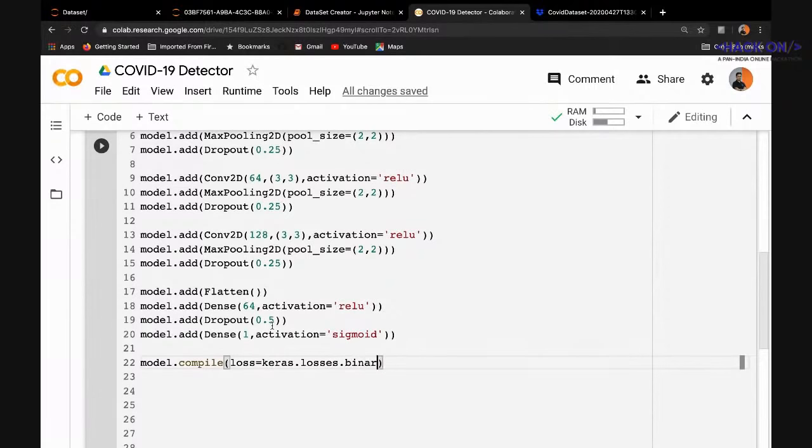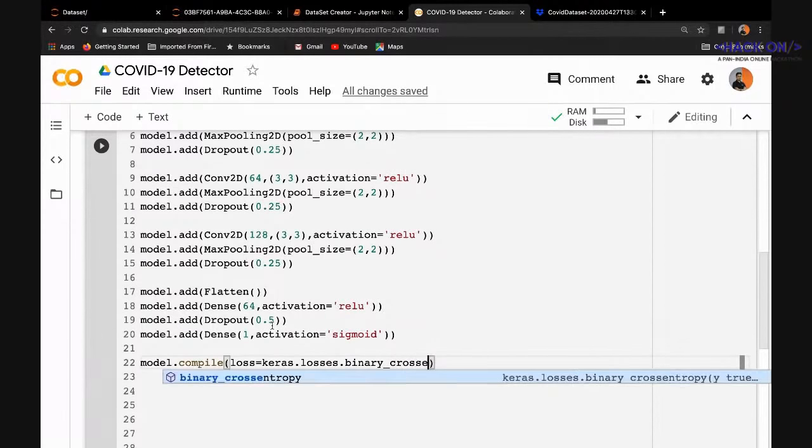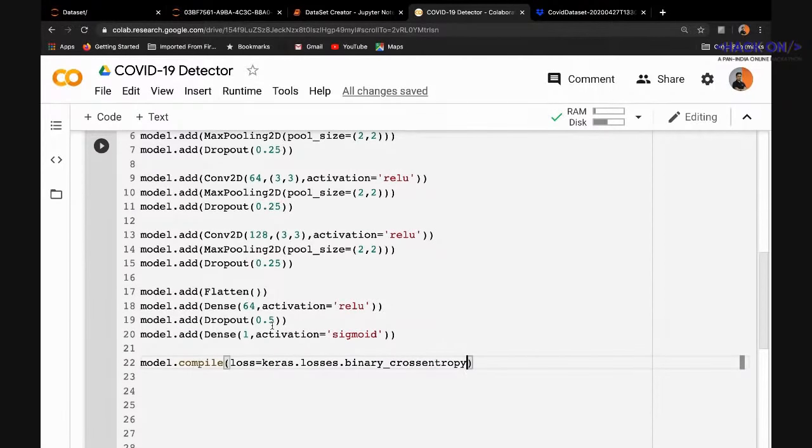The optimizer is Adam with accuracy as the metric.